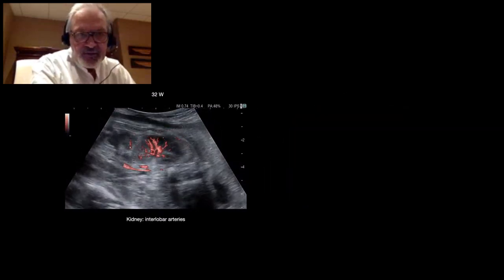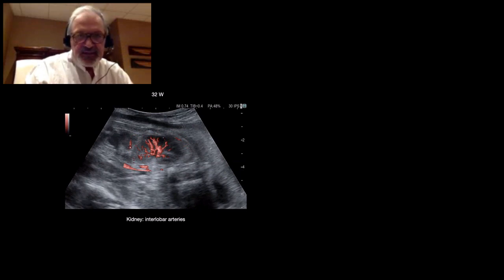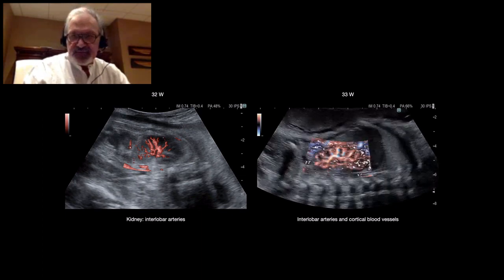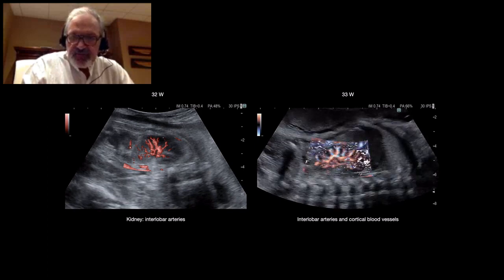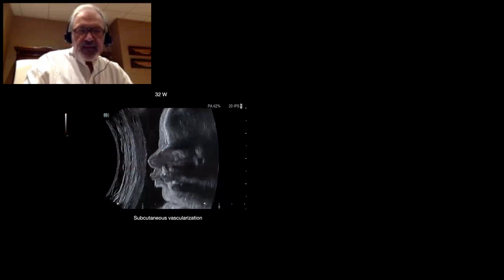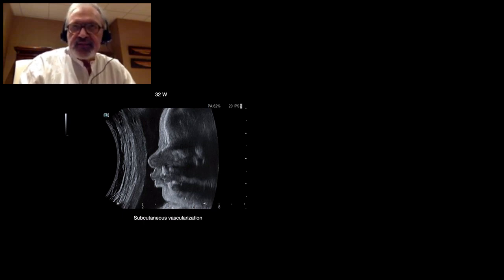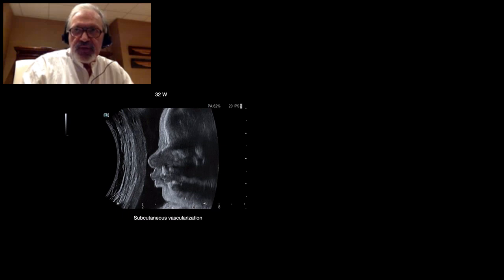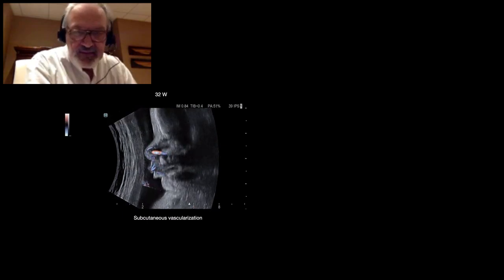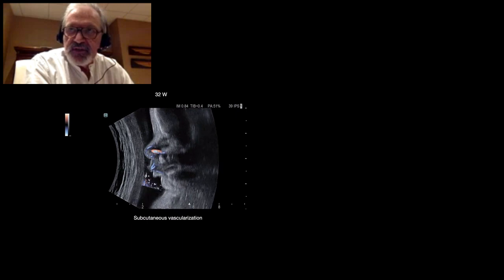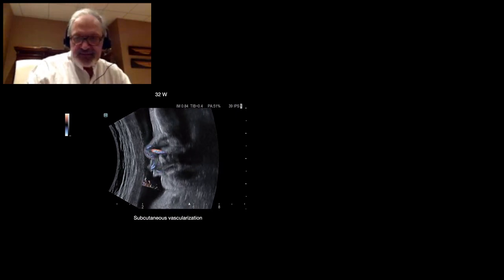For the kidneys, here we have the interlobar arteries. And if we increase the gain, we can see interlobar arteries and cortical blood vessels — this would be useful when we have kidney disease. This is a special picture: when we make a section like this, we can see a small hypoechoic band just under the skin, and with DFI, you can see the small subcutaneous vessels — the subcutaneous vascularization highlighted by DFI.